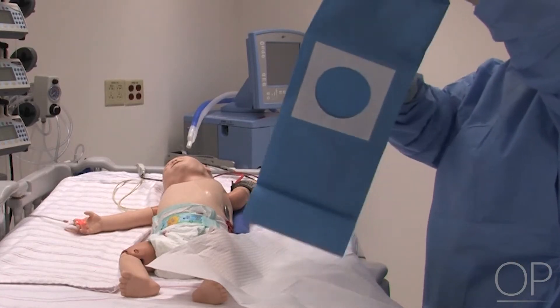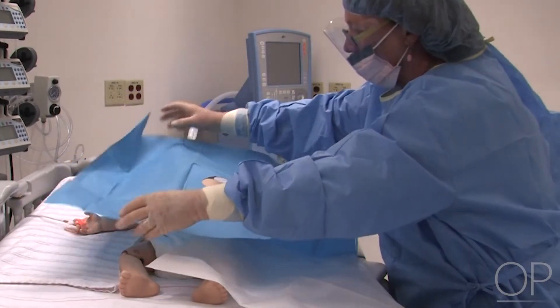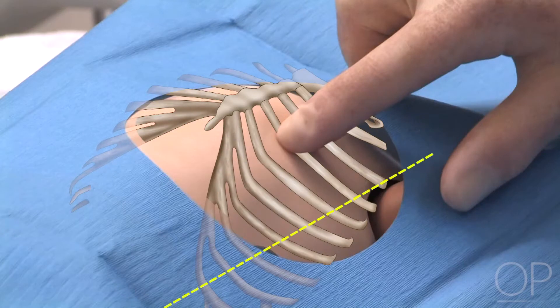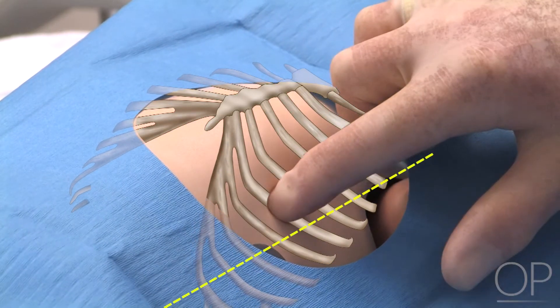Drape the surgical area. Identify landmarks: 4th, 5th, and 6th ribs at the mid-axillary line.